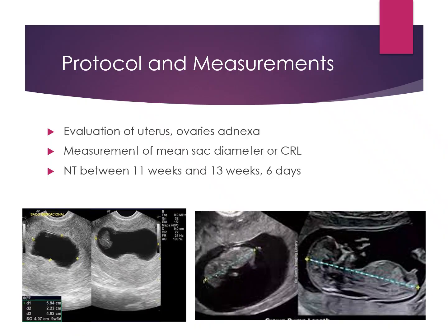All right, let's get into protocols and measurements. The first thing that I always do when starting an OB ultrasound is I take a look at mom. And everyone is so excited to see this baby. Mom's like, can I see the baby? Can I see the baby? And sometimes you just have to explain it. Like, yes, we are going to look at the baby, but first I want to make sure that you're good. So I'm just going to take some really quick measurements, and then I will show you everything that I can as soon as I get these.